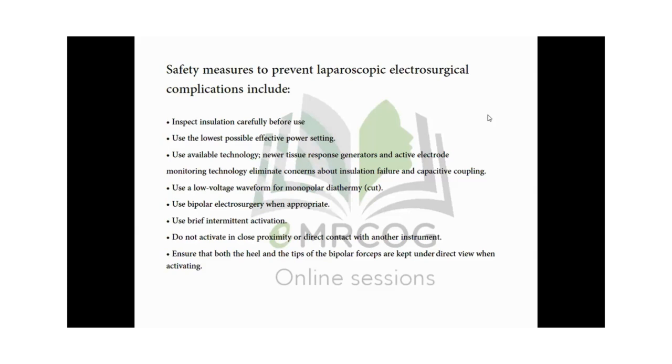What else? Use brief intermittent activation, not continuous activation. Do not activate in close proximity, and of course, not in direct contact with another instrument. So if you are using two instruments, make them apart before activation of diathermy, because this is very risky to have direct coupling or high amount of voltage or even lateral thermal spread.